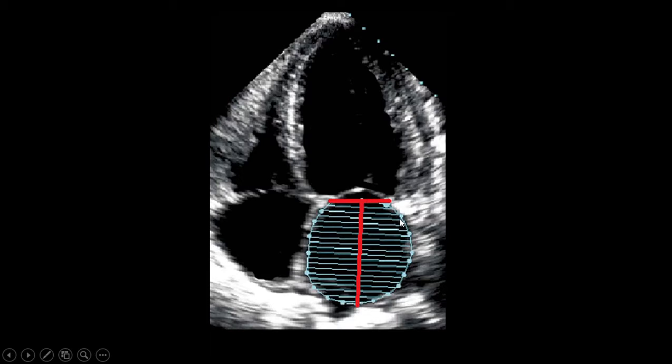As a general rule, your atrium, left atrium especially, should be even and of regular shape, usually rectangle, oval, close to round. If it's too irregular, there are two reasons: you are off the axis, or you are tracing the wrong way, tracing a different structure.